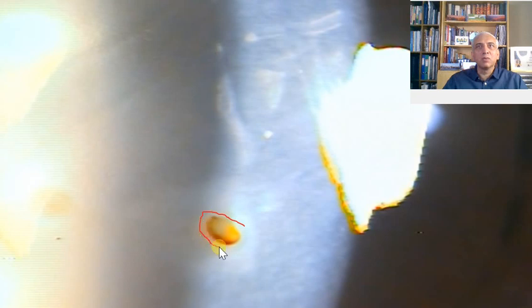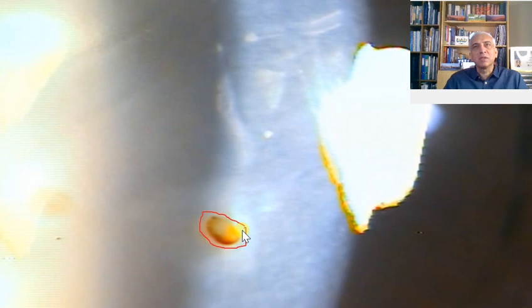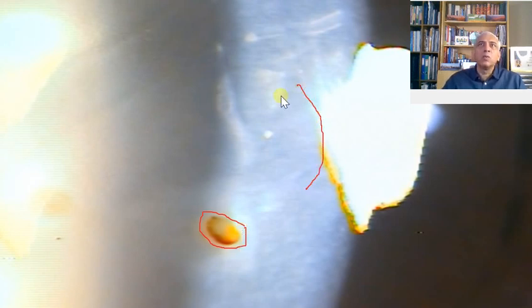You can see this foreign body which is lodged over here. The important thing which you want to see is if it's an iron foreign body or just a vegetable foreign body. And then the other thing is what is the depth of the foreign body. Sometimes it is just on the surface.